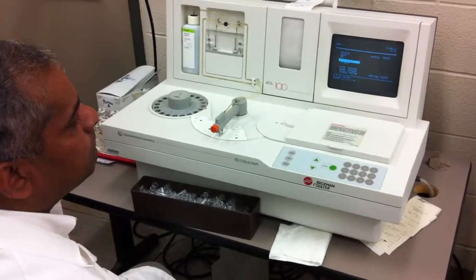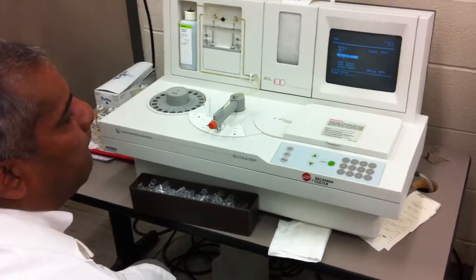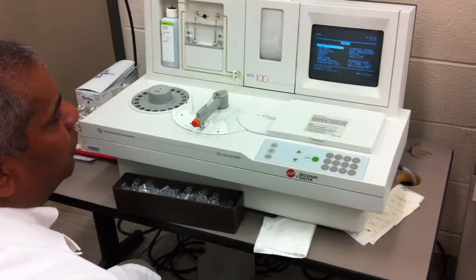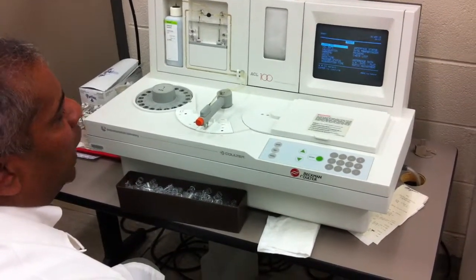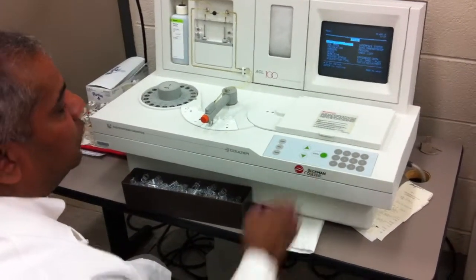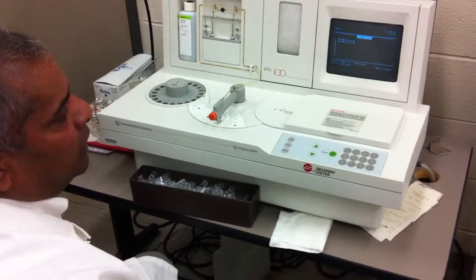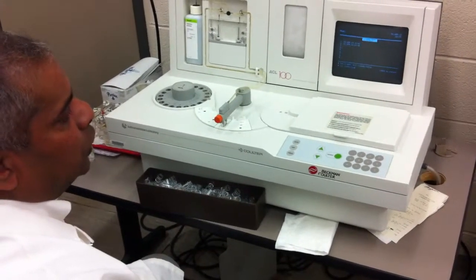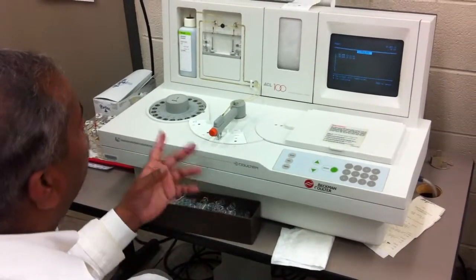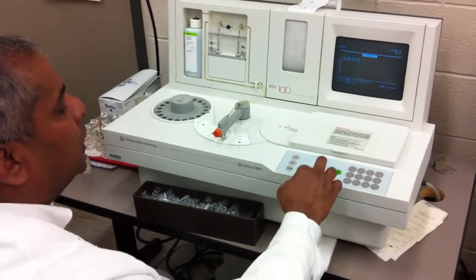All right? There's lots of special tests in this machine. If you press program, it brings you into the programming, which you will need to know. One is the load list. Every time you use this machine, if I press enter, you're going to see it gives you 9 load lists to start. Right now, how many of them are used up? Two. So you can use those load lists, okay? The next one, when we go in and ask you to choose a load list, I will have to choose number 3, okay?